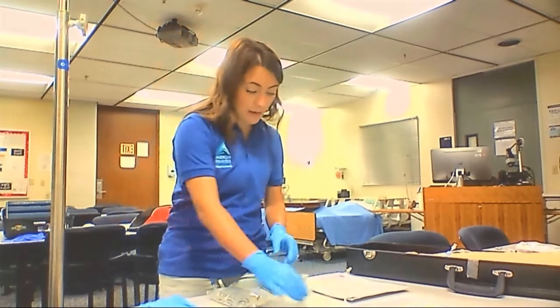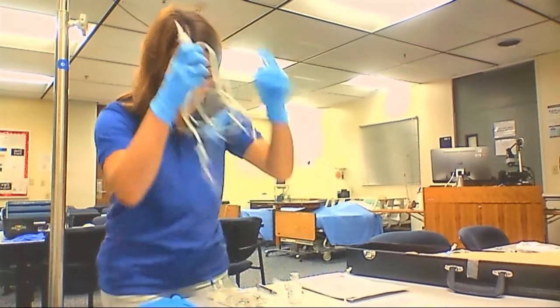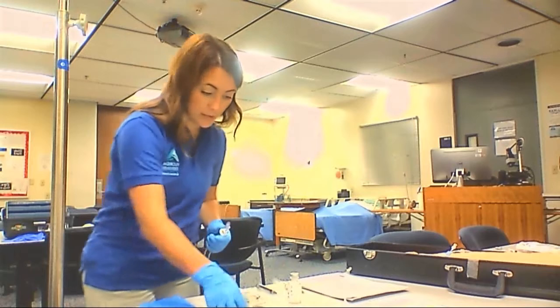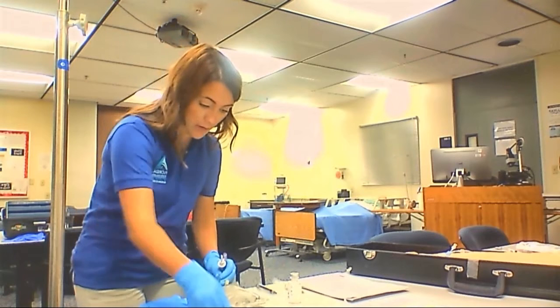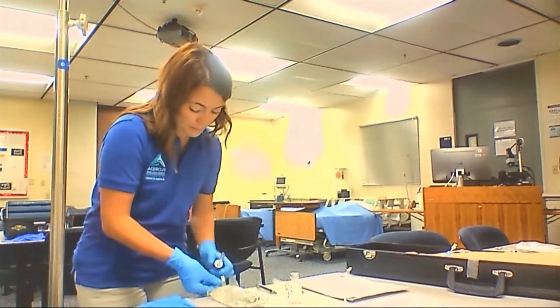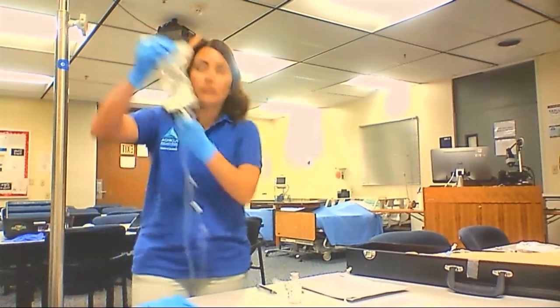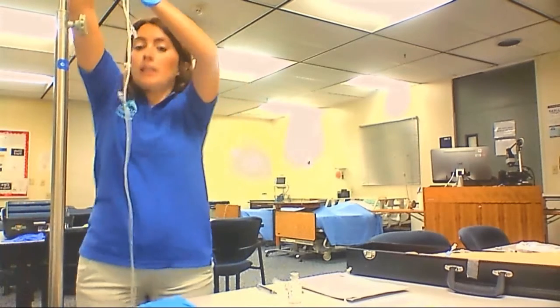At this time, I can now attach the needleless device and begin hanging my bag. Once again, I want to make sure that I pop the top, clean with alcohol here, and clean with alcohol here. Okay. Now, I can go ahead and get my bag hung.